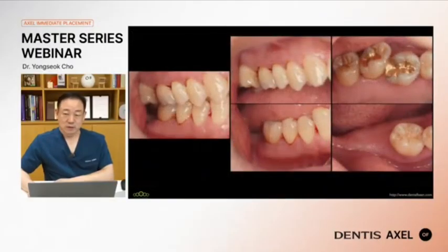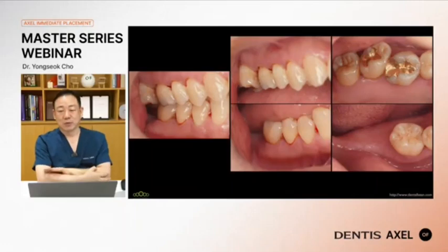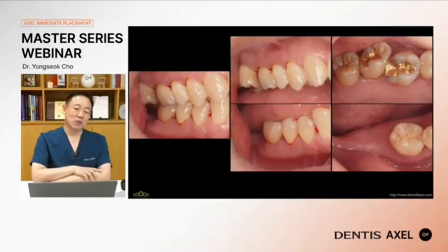Look at the intraoral view. Number 7 alveolar ridge decreased compared to number 6. How much volume decreased? I feel it is more than 30%, almost 50% of bone volume reduced at the coronal position. But in number 7 case, I don't consider complex surgery in any situation. Although coronal bone is lost, the middle or basal bone is wide enough, so we can simply manage such a width problem.